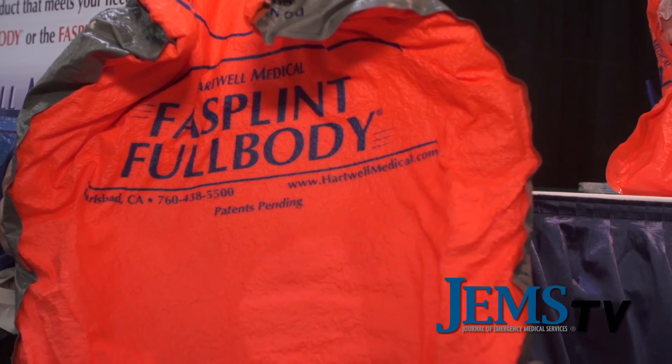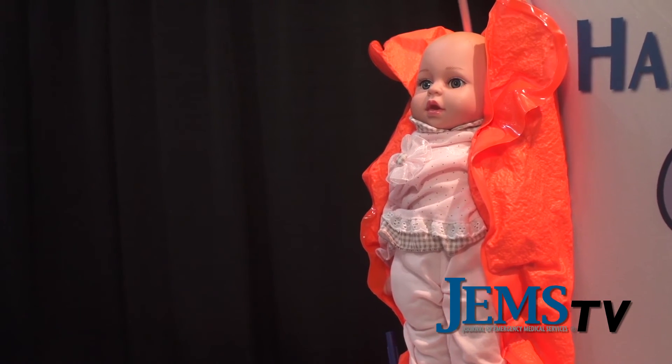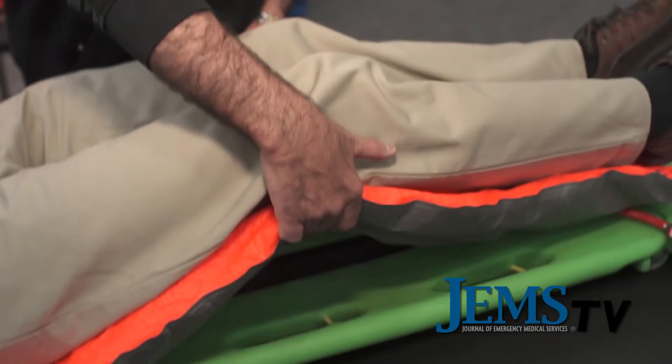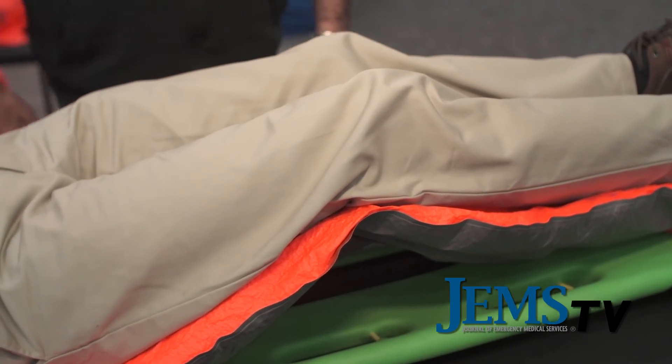One thing I was really interested in — you've even got a size for infants, tell us about that. With our Fasplint line for extremity splints, the medium size splint can be used for infants, and with our new Fasplint Full Body many are seeing a dual role — using it as a pediatric immobilizer. It's really left up to the imagination of the EMT or paramedic on scene. Because they mold to each individual shape, they work very well, and they're especially nice for the geriatric patient.